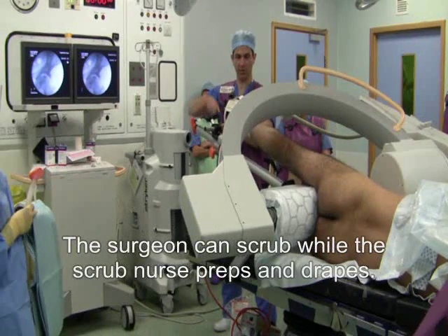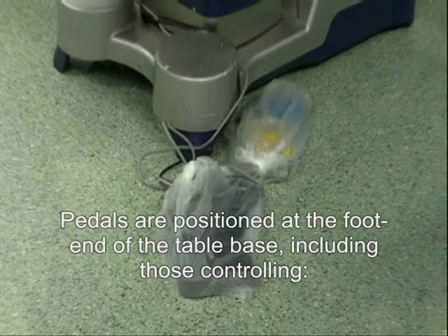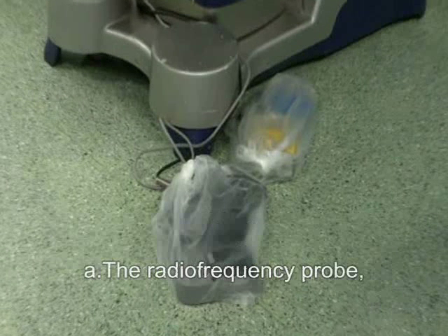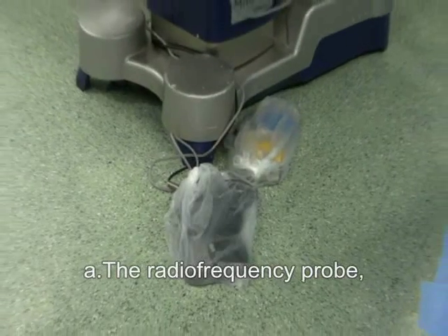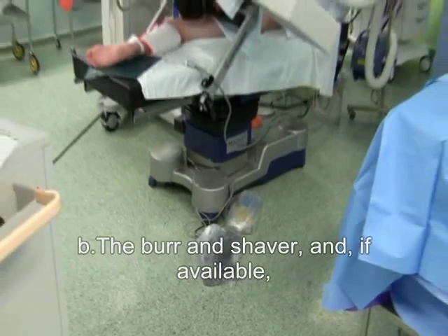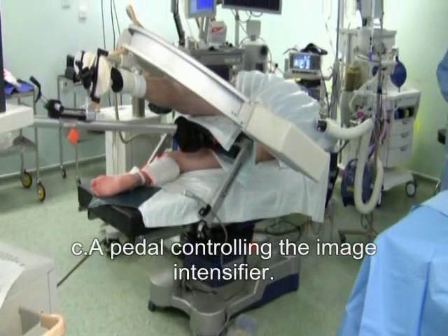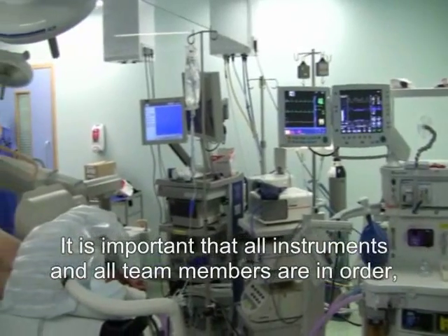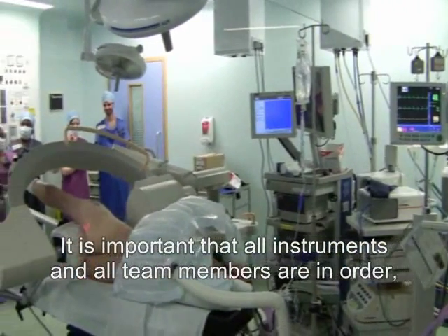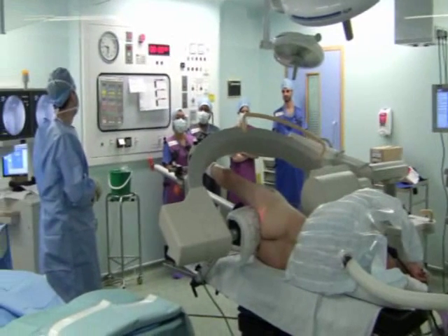The surgeon can scrub while the scrub nurse preps and drapes. Pedals are positioned at the foot end of the table base, including those controlling: A, the radio frequency probe; B, the burr and shaver; and if available, C, a pedal controlling the image intensifier. It is important that all instruments and all team members are in order according to a standard theatre floor plan.